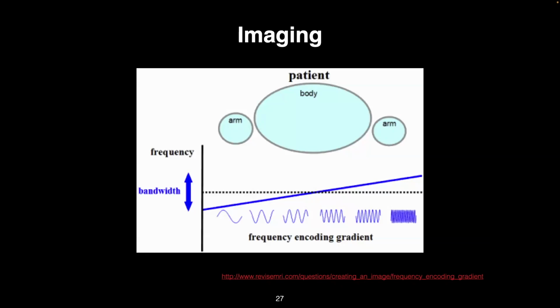What we can do now, within that slice, is turn on a gradient across. Previously we were showing a gradient along the subject's head to foot, along the Z-axis, if we're thinking of the magnet field aligned horizontally in Z. And now across the subject's right side to left side, that's usually along the X-axis.